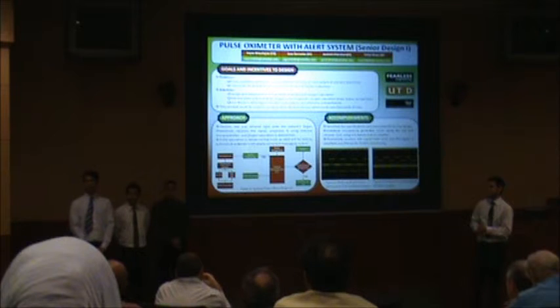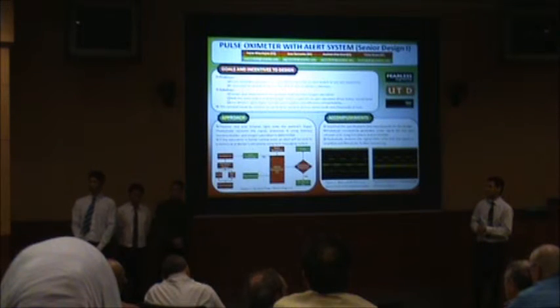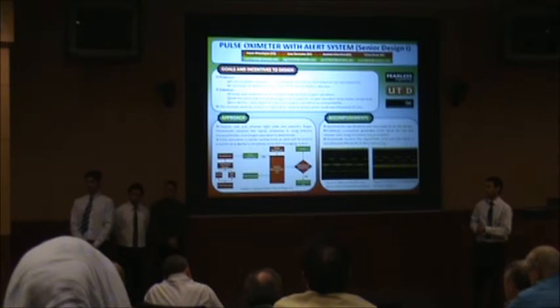You're using a matched photodetector pair? Yes, sir. They have to be matched, because the red light is 660 nanometers and the infrared is 940 nanometers, so we pick the photodiode within that range. You use it on the finger, right? Yes, sir.